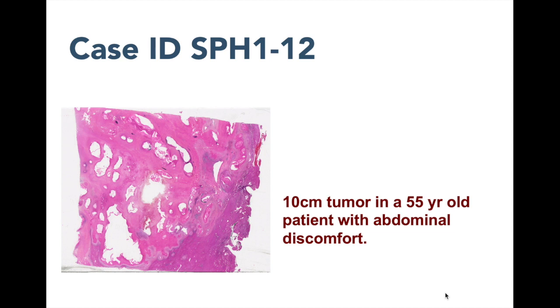Case number 12, you have a slide from a surgical resection of a 10 centimeter tumor developed in a male patient, 55 years old, who consulted for abdominal discomfort, and he came from the east of France. That should maybe give you an idea or a hint to make your diagnosis.